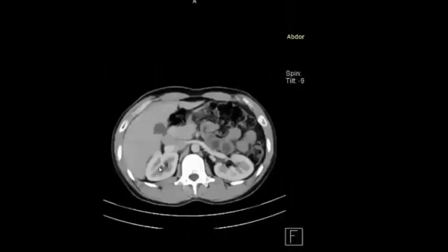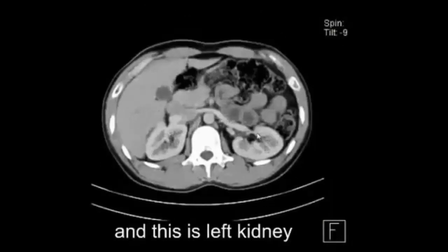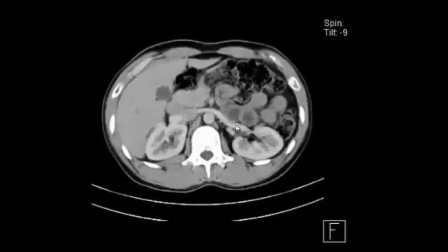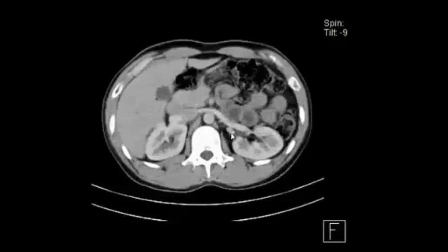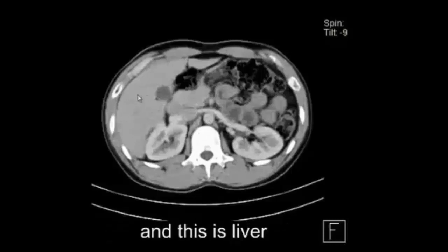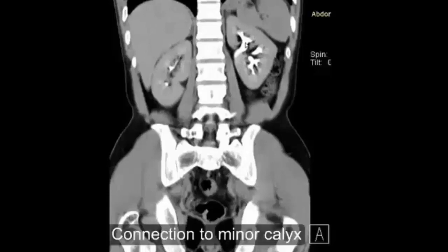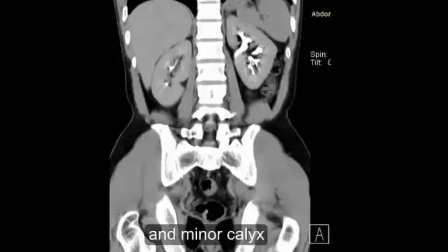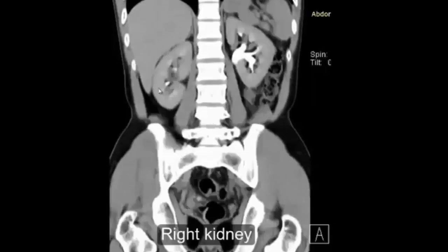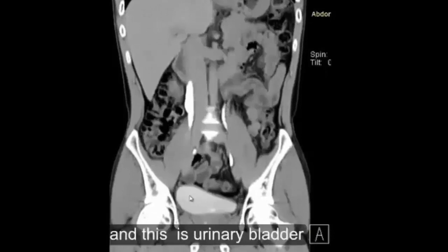This is an axial image. This is the right kidney and this is the left kidney. Renal vein, renal artery, abdominal aorta, and this is the liver. Right kidney, left kidney, connection to minor calyx, major calyx and minor calyx. Right kidney, left kidney, renal pelvis, right ureter, left ureter.